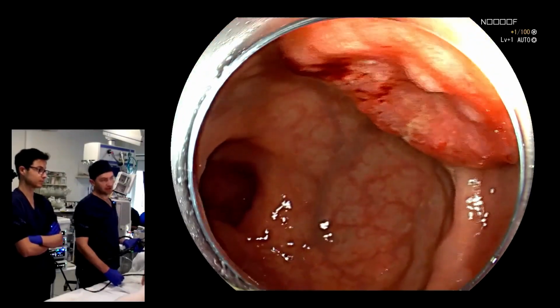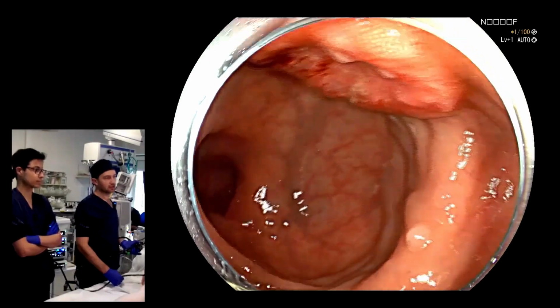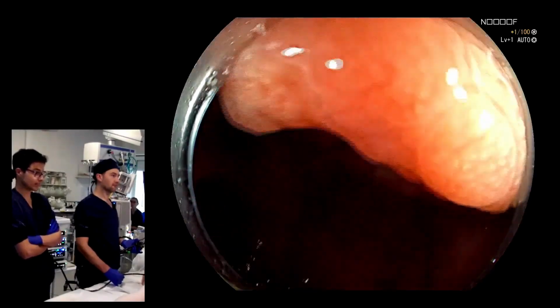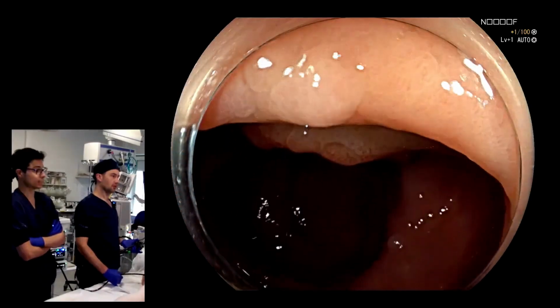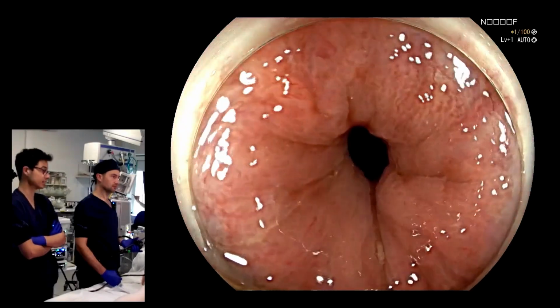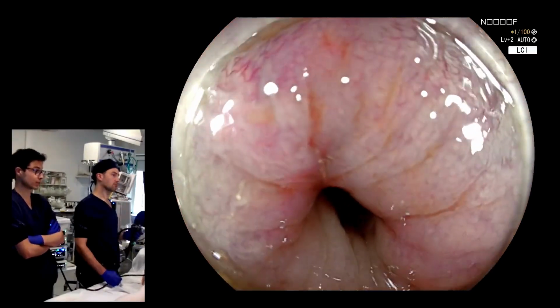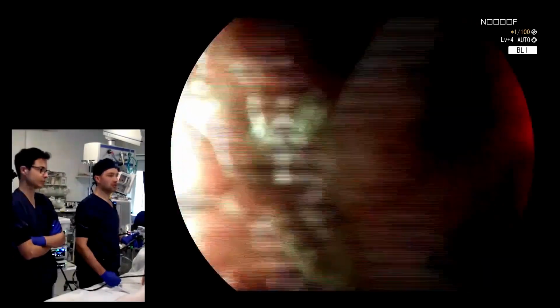Okay, but we've got that information, but do we want to think about further characterization, and also probably distance from the anal verge? These are probably two other important things, right? It is important, and needs to be also discriminated. The anal verge and the dentate line, they're not the same thing. The dentate line is the squamocolumnar junction, and it can also be appreciated in retroflexion. Yeah, absolutely. Maybe better, but we saw it already. And also, I think BLI can help you to distinguish the columnar from the squamous epithelium. So here we go. You see it nicely here. And so this is the dentate line.